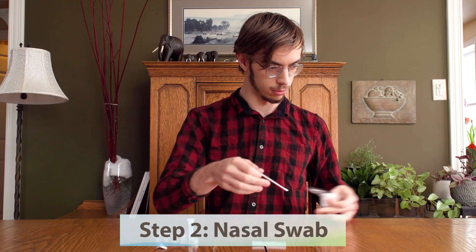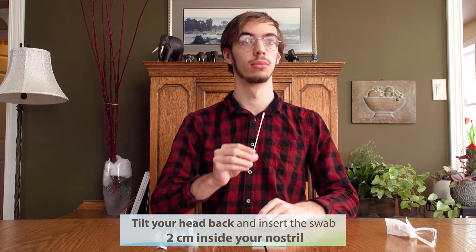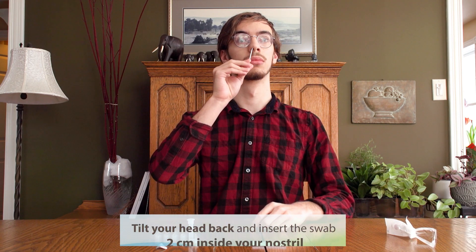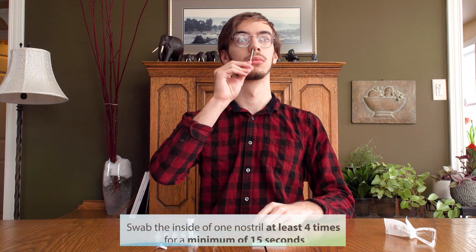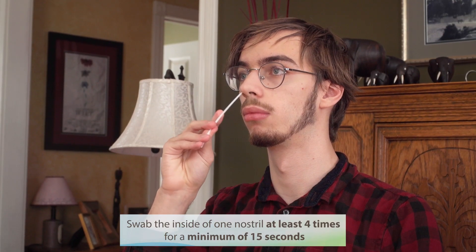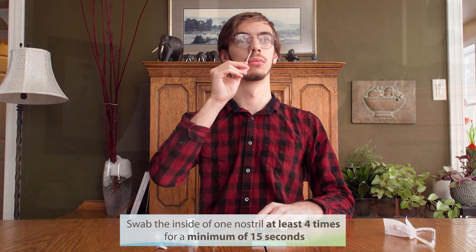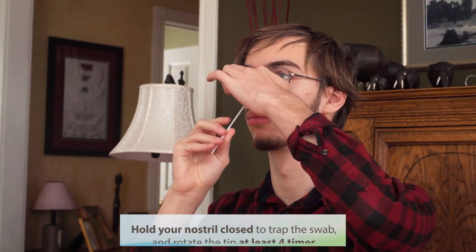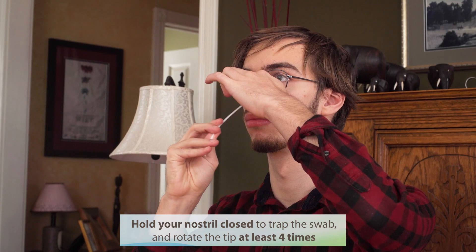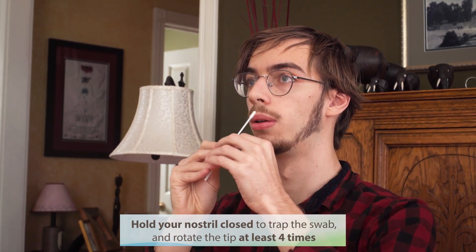Step 2: Nasal swab. Tilt your head back and insert the swab 2 cm inside your nostril. Swab the inside of one nostril at least 4 times for a minimum of 15 seconds. Hold your nostril closed to trap the swab and rotate the tip at least 4 times.